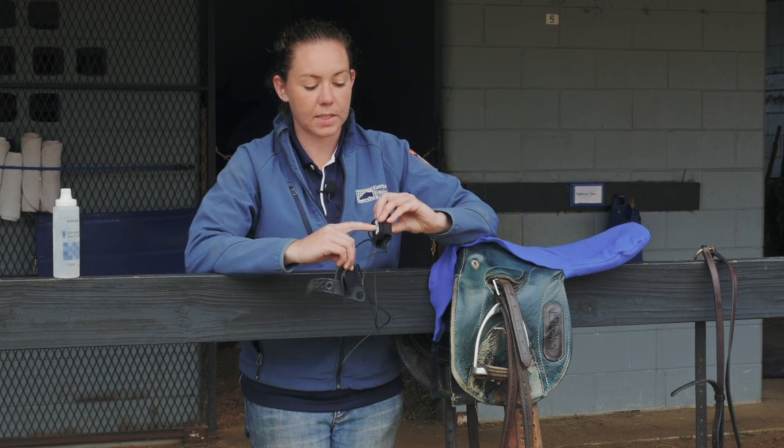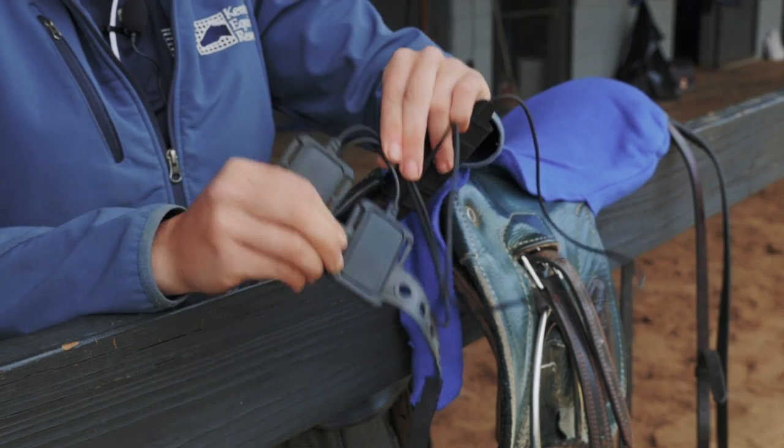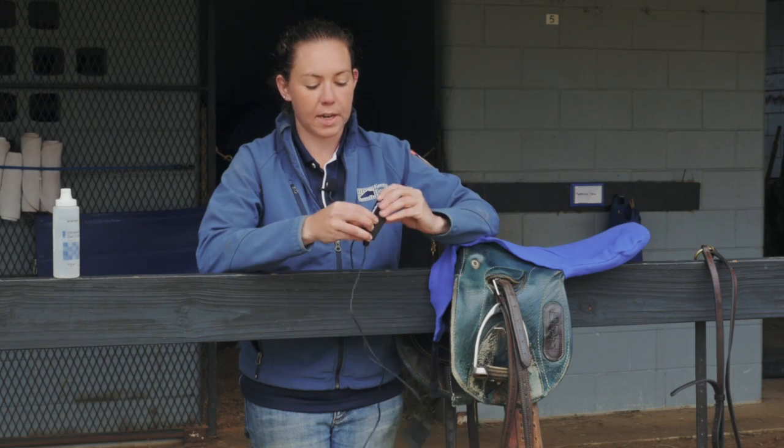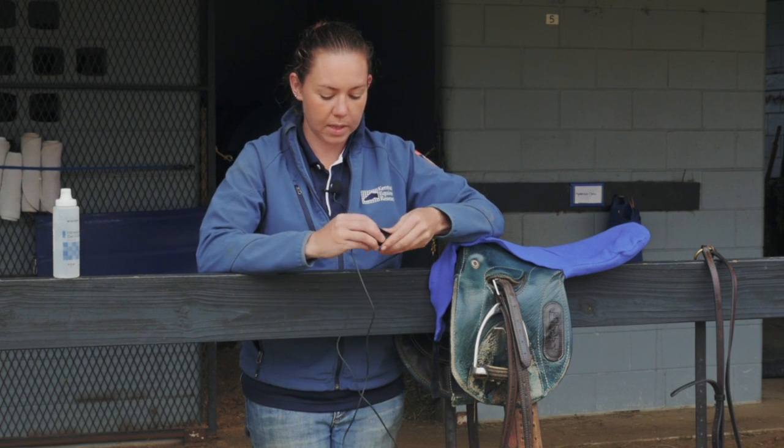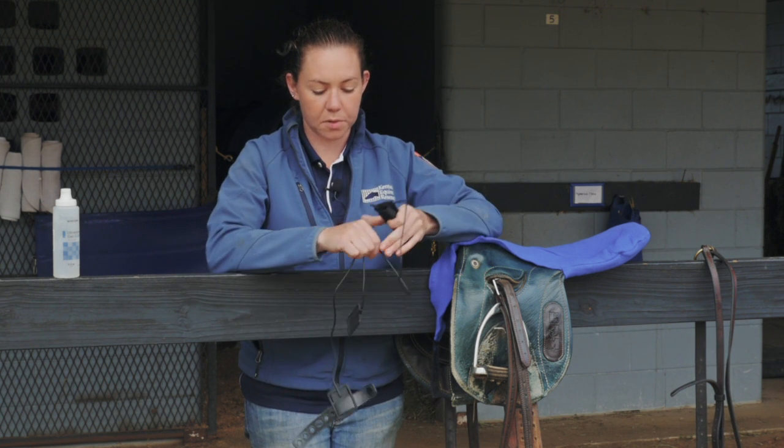This is the heart rate monitor. It consists of the transmitter and two electrodes. The transmitter has Bluetooth in it, which will connect to your phone, and the electrodes are what you connect to the horse to get the heart rate.